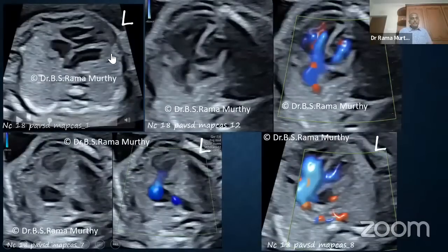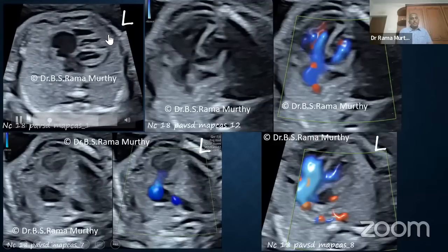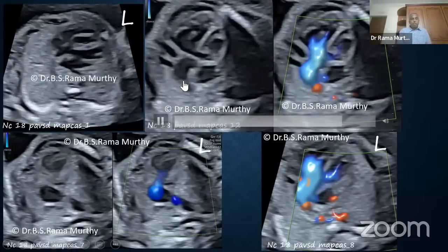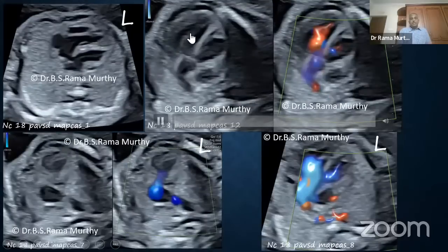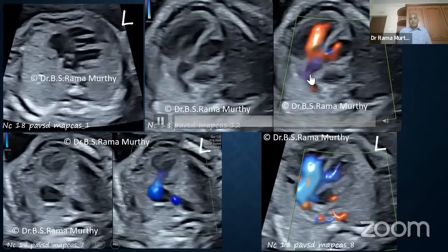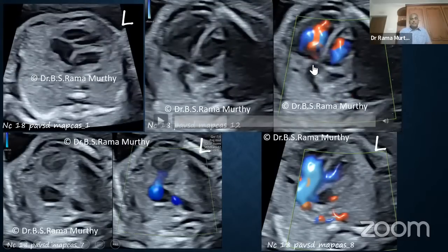Okay, now here is another case. That's the four-chamber view, showing you the fact that there is an axis rotation. There's a left axis rotation. When I go to the LVOT, you find that there is an overriding aorta that you can see here. Overriding aorta, and you have almost equal participation of both ventricles pumping into it. That's the color Doppler, which is telling you the same, right? So therefore, overriding aorta, it is arching and it is equally committed.